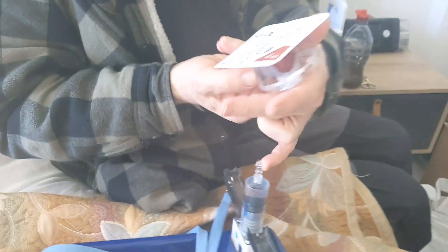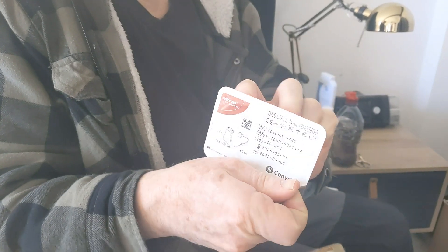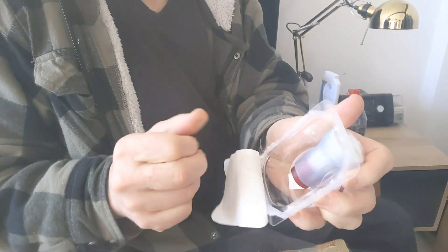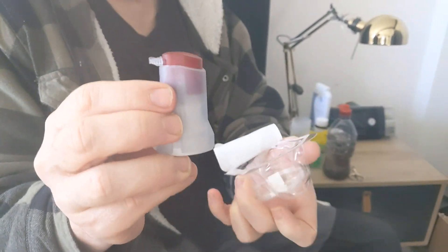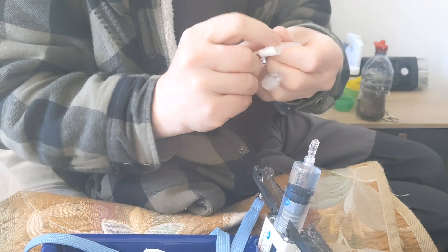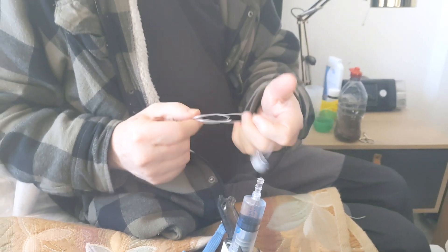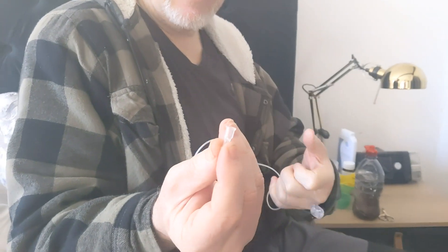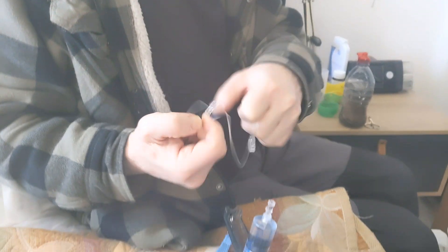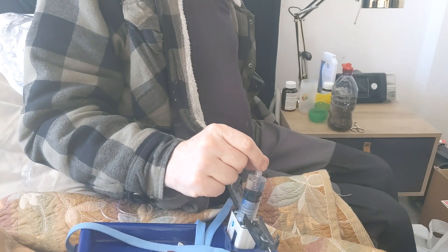Next, we have this part which has two things inside it — there's an arrow I can point to. I take the cannula needle and the connector; the plastic I can throw away. I separate these two parts — this part will go on to there.